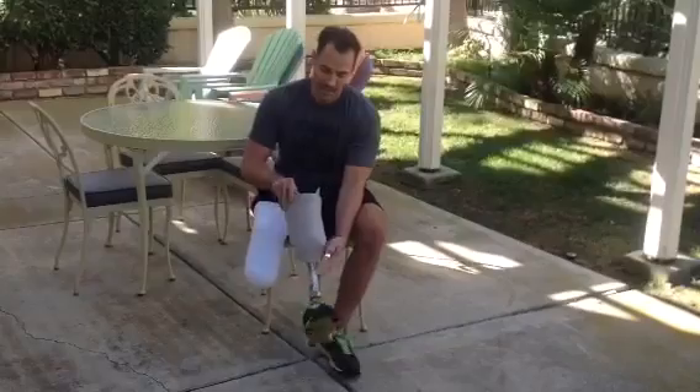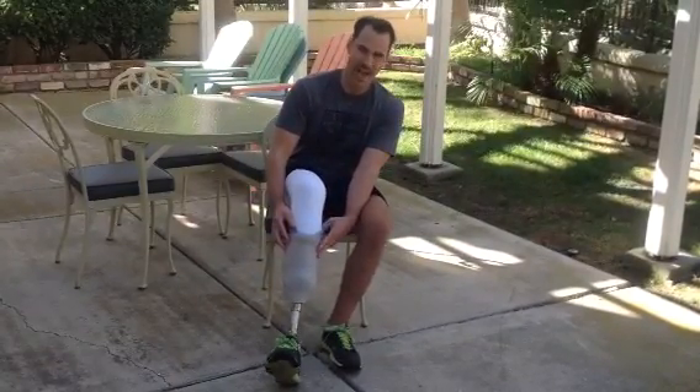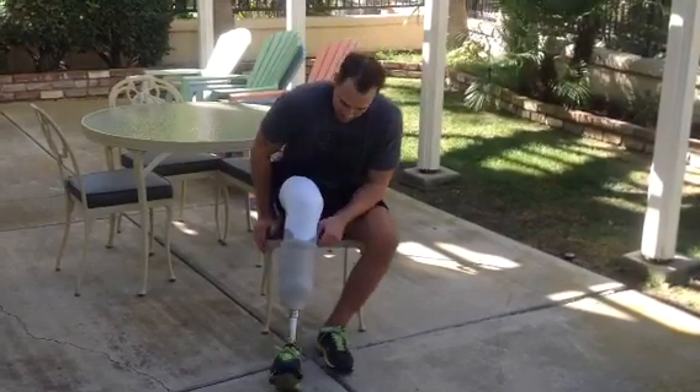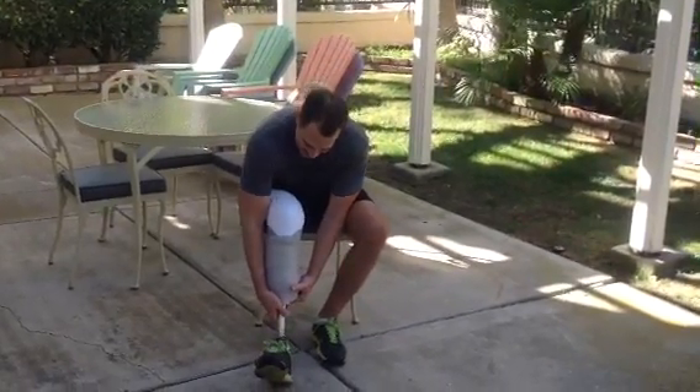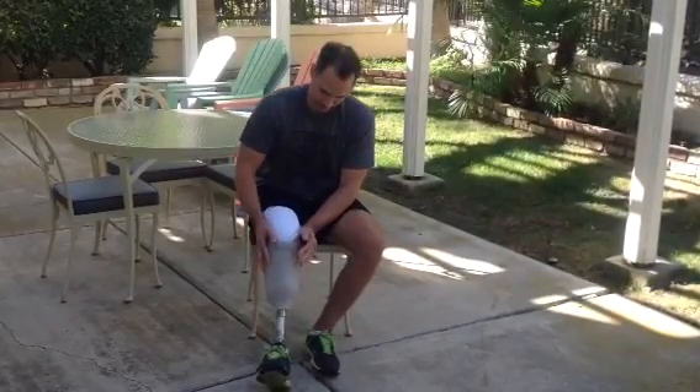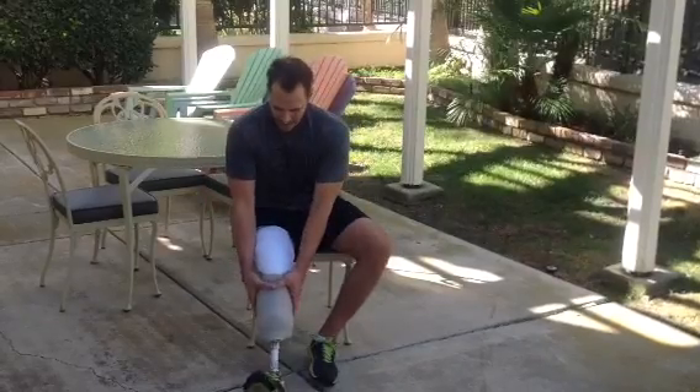Here's my leg. This is a suction fit, so I don't have to have any pin system to connect my leg — it's full vacuum. Stick it in, then I roll up the liner.